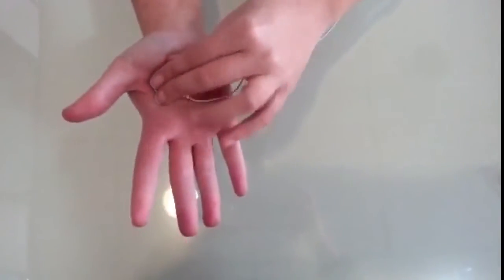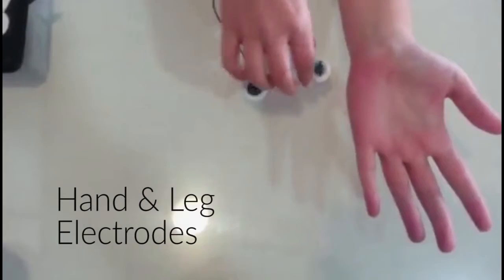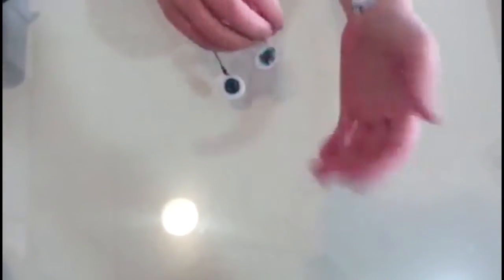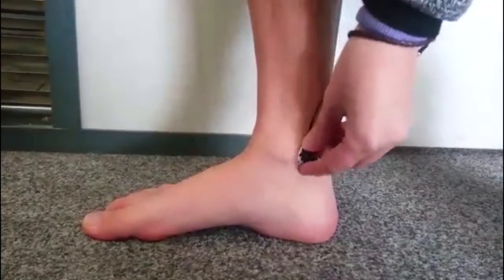Hand and leg electrodes: place the positive electrode on your right wrist and the negative electrode on your left wrist. Then place the ground electrode on your right leg, as you see in the video.